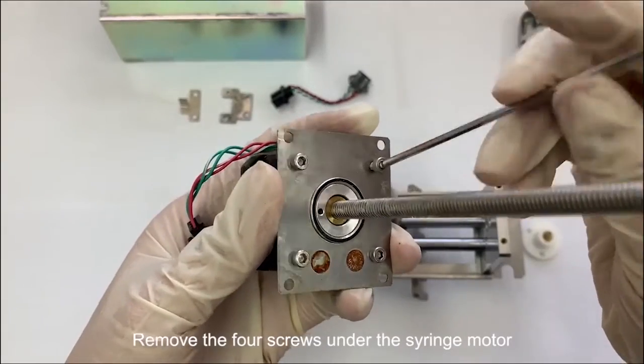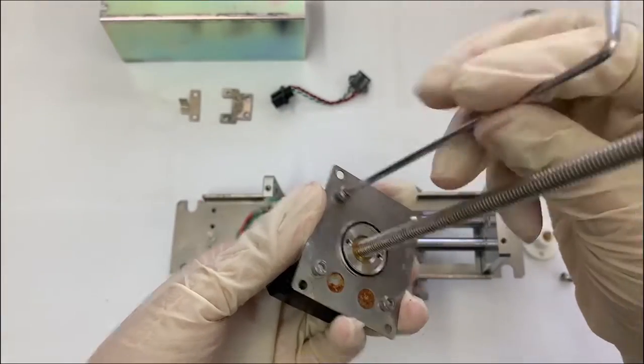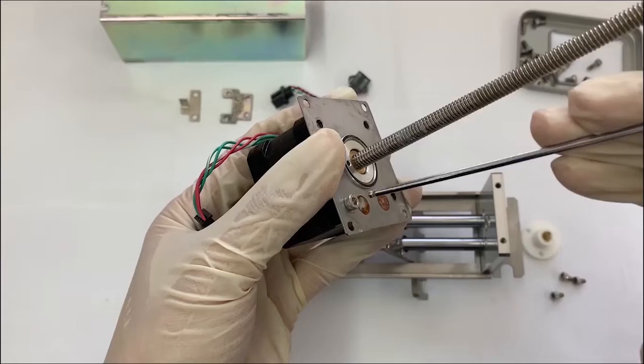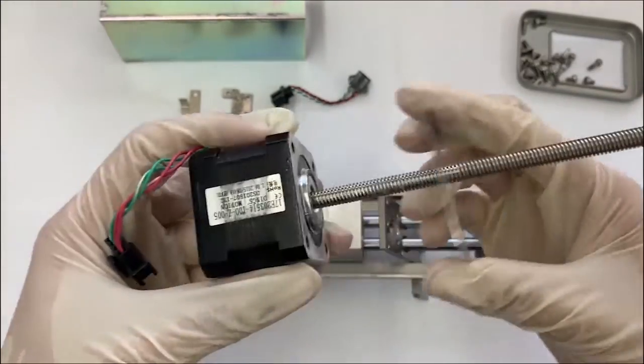Remove the four screws under the syringe motor.